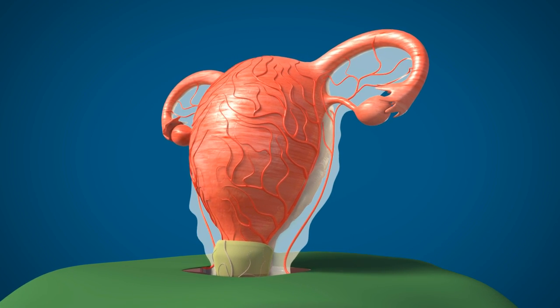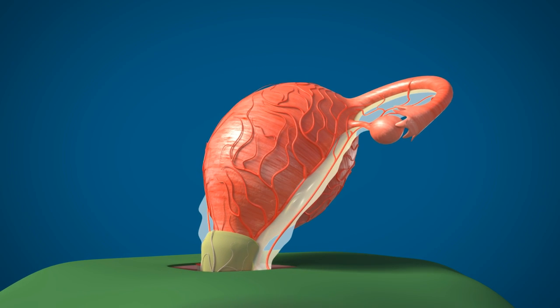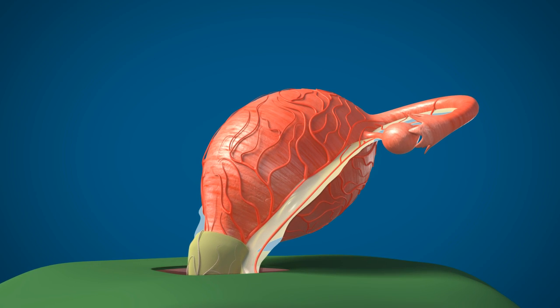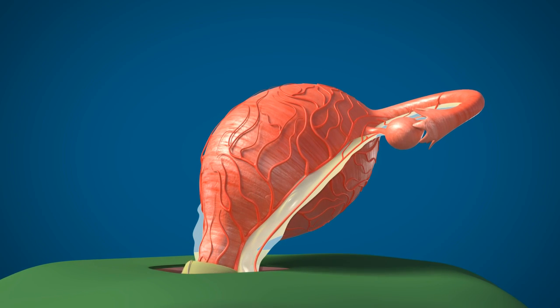This is the postpartum uterus exteriorized. The uterus is pulled anteriorly to expose the UV fold. The UV fold is opened and the bladder is pushed down like this.